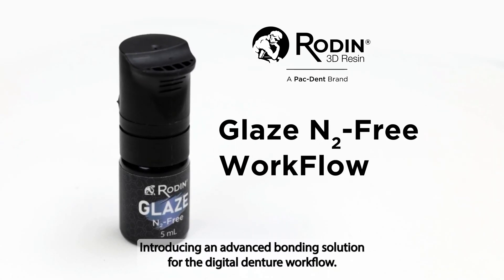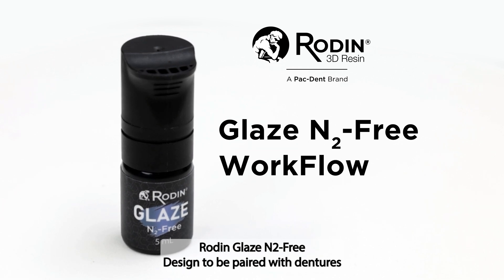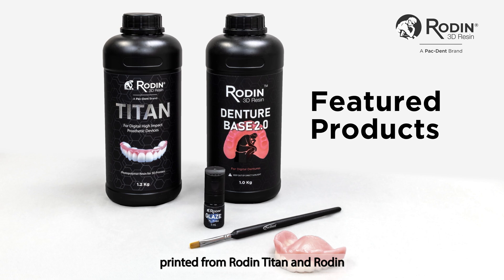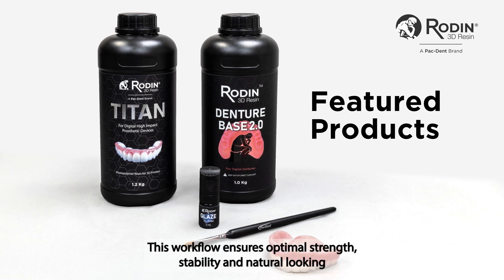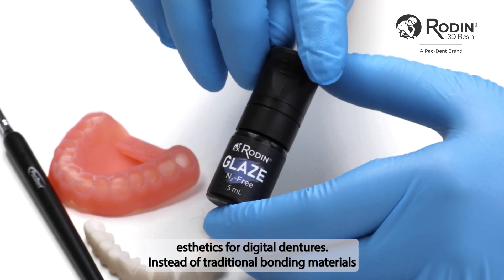Introducing an advanced bonding solution for the digital denture workflow: Rodin Glaze N2 Free. Designed to be paired with dentures printed from Rodin Titan and Rodin Denture Base 2.0, this workflow ensures optimal strength, stability, and natural-looking aesthetics for digital dentures.